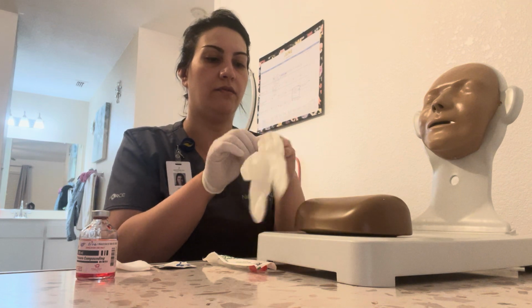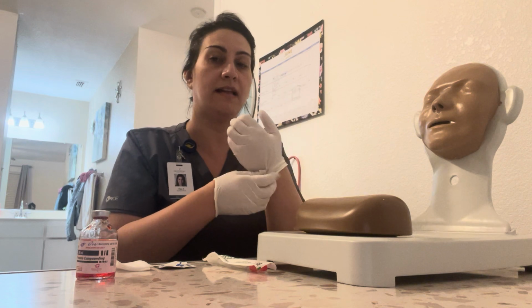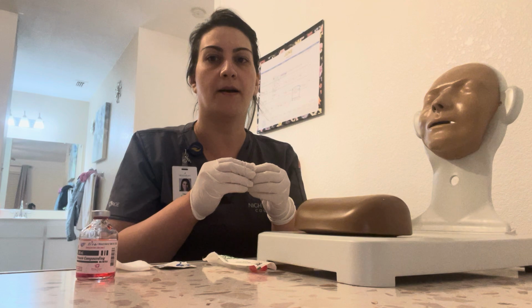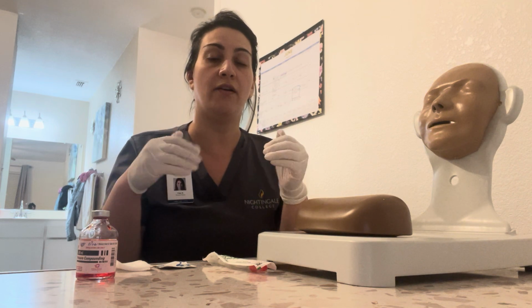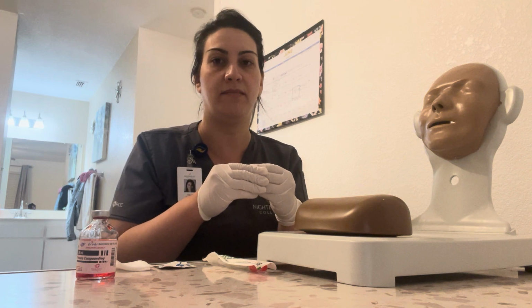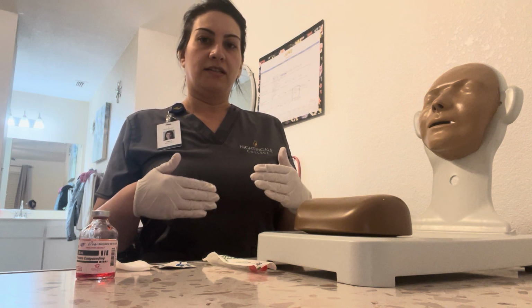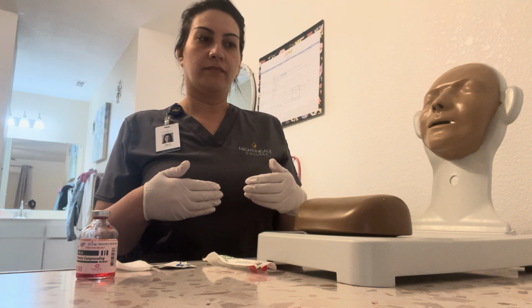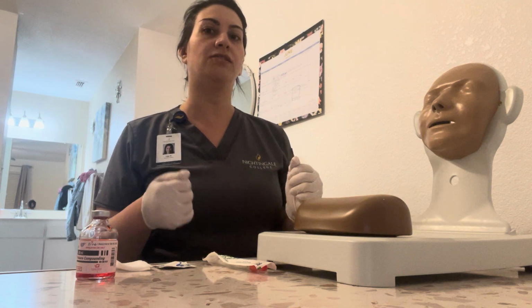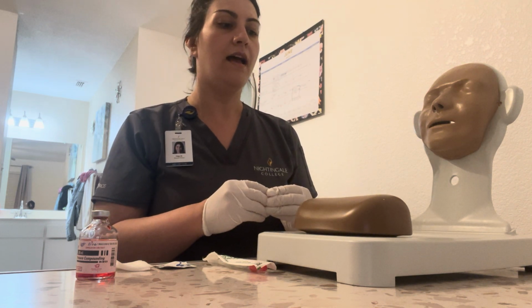And we're going to talk about the site. So there are 3 locations that my patient can be receiving the subcutaneous injection. It could be the upper arm, it could be the thigh or the abdomen. Due to rotation, my patient wants to receive it in the abdomen, which is left or right side, just below the rib cage. And it's going to be right here on my patient.